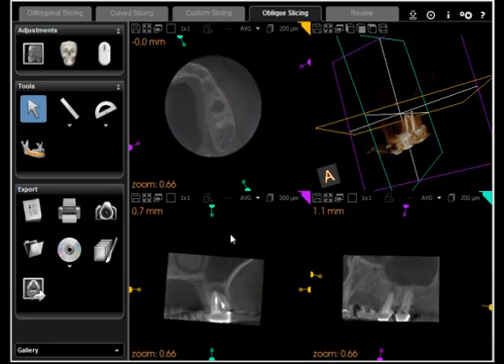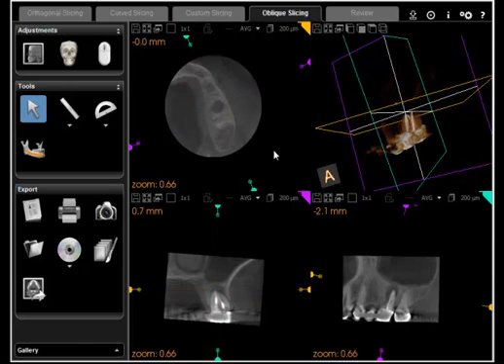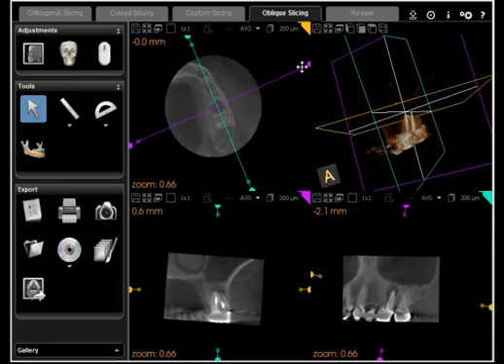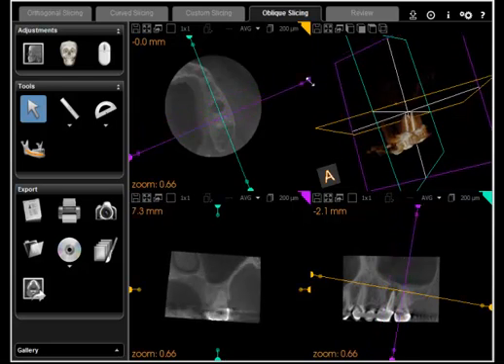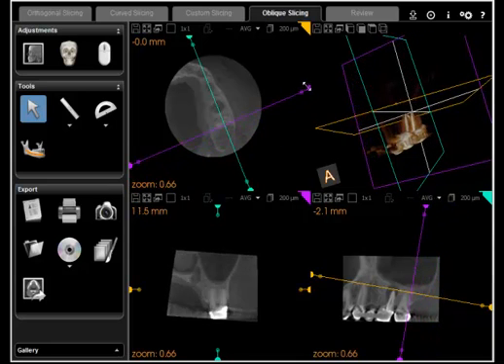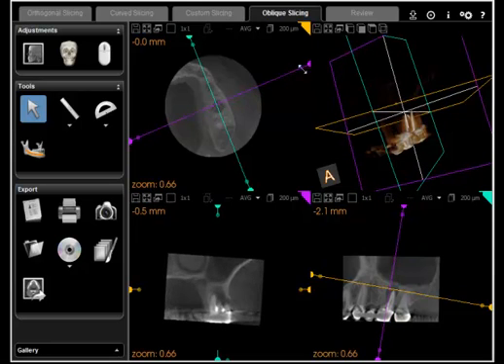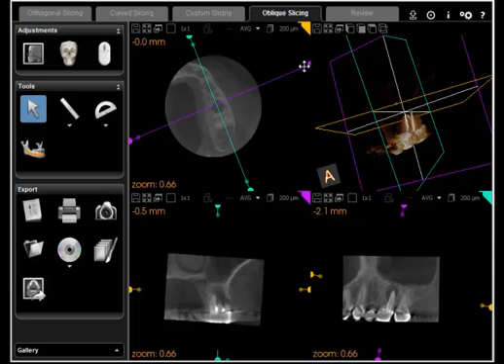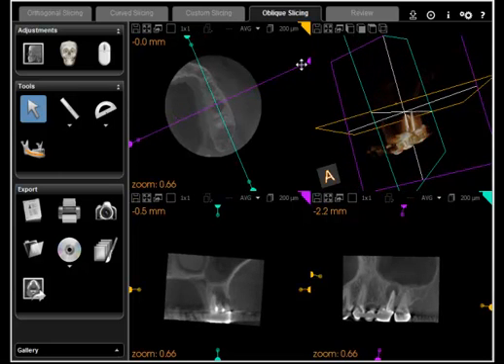This function is available in all three windows. The purple is the coronal slice, and as you mouse over the semicircle and move that slice back and forth, it allows you to move that image and line it up with the roots. When you mouse over the circle in any color and hold the left mouse button down, you can change the angle of that slice.